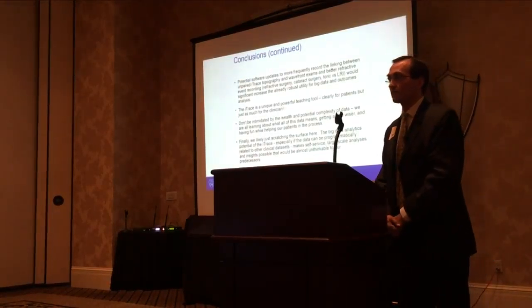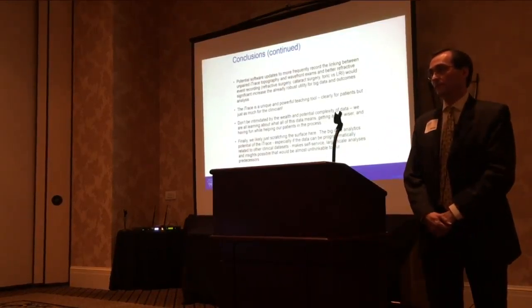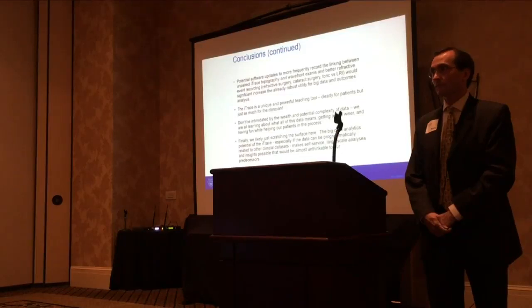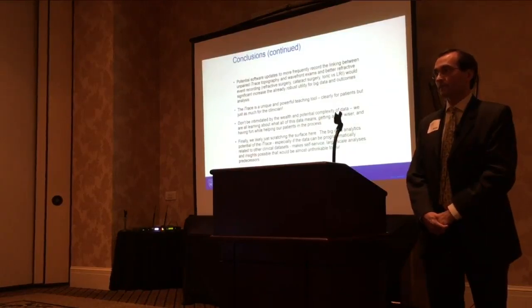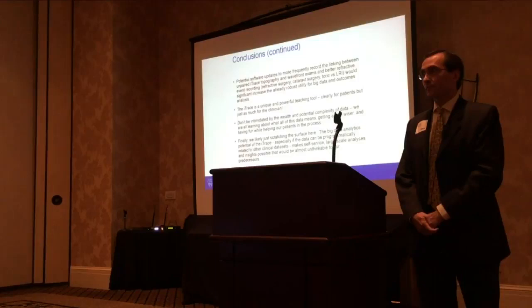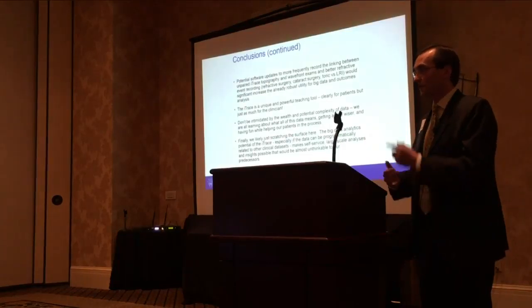Thank you. The issue is, you're right, Mike, it's manual right now. We actually just had a discussion earlier about how to make it automated. You're talking about big data analytics, and if it's manual, it's not going to be 30,000 iTrace exams. That's our challenge. We can do it manually, but it's more for when you have a problem patient and you can see the centration, more than what you were talking about. Yes, so I think it's clearly open for somebody to sit down with their patients and do 100 of these manually. I don't think we can do it in this way yet.